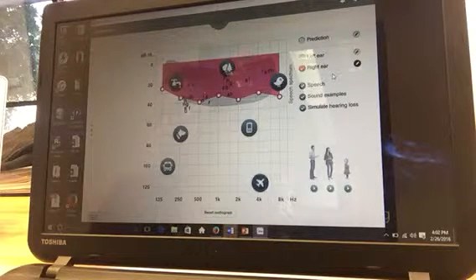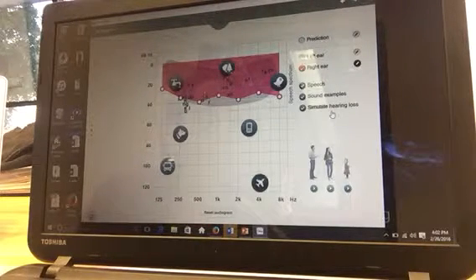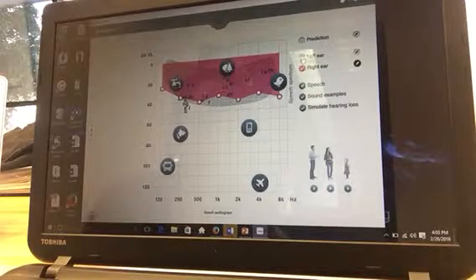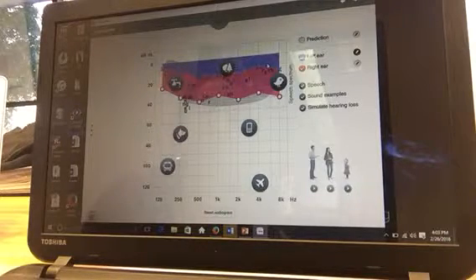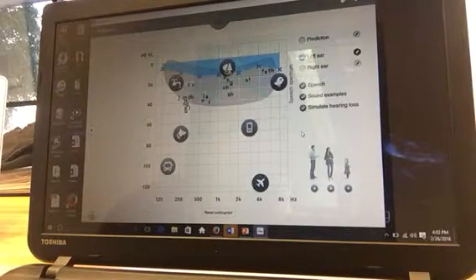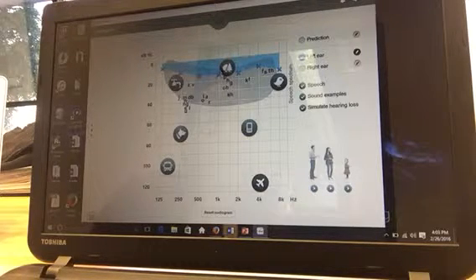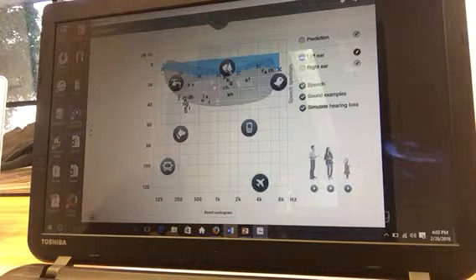Okay, now with his aided ear, with the hearing aid, this would be an example of what he would be able to hear now. So using the left ear as an example, let's take away. Now the X's, as you can see, are where he's hearing with the hearing aid. So now he's able to hear many of the previous sounds that he wasn't getting. So let's take a look at some of the sounds that he was previously missing that he can now hear.